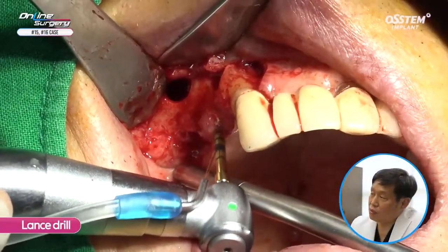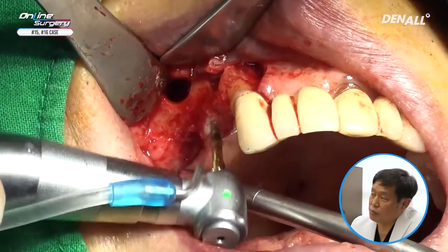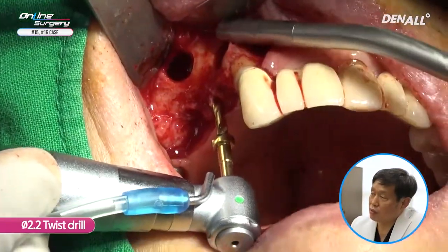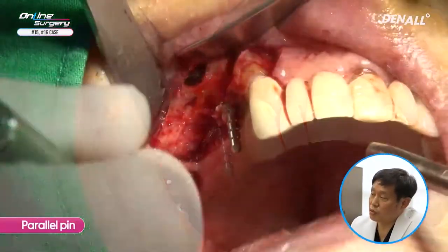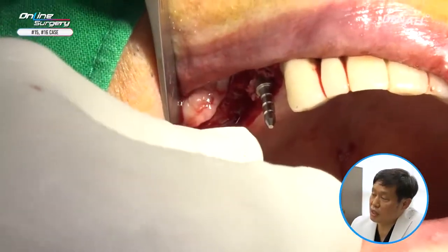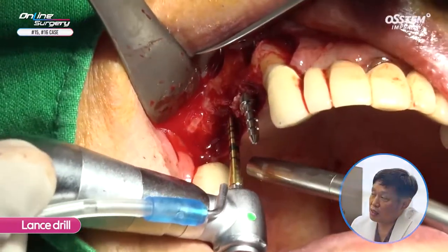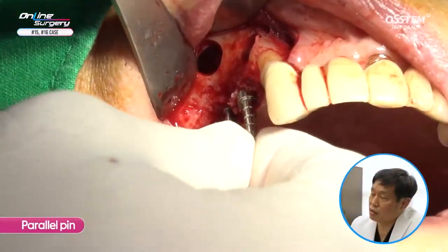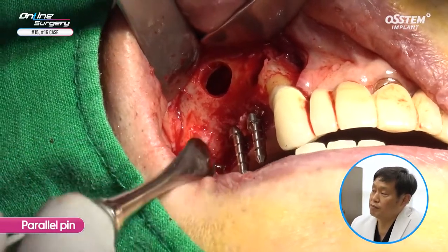A lance drill is used. You're in the desired position. In number 15, the drilling position is checked. The 2.2 twist drill is used, and you can see it's connected to the sinus floor. A parallel pin is used to check the position and the relation with the antagonist. In order to find the position, I'm repositioning the crown of the existing implant. A parallel pin is placed, and I'm considering the position and form of the mesial implant.